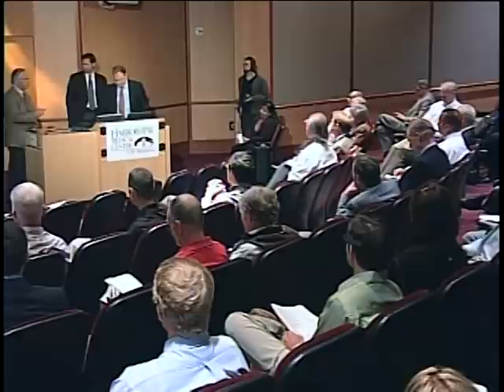Sean, do you want to address the first question about flexibility in addressing or changing or staging type C pilons and converting them in the first stage to type B pilons? Sure. And I think it's all related when you talk about being strategic. It's strategic with regards to the fracture pattern and strategic with implant placement. And then I think appreciating the primary mode of failure based upon what the injury radiographs look like. So is it a varus failure pilon or a valgus failure pilon? And then that's going to determine the size and location of the implant.